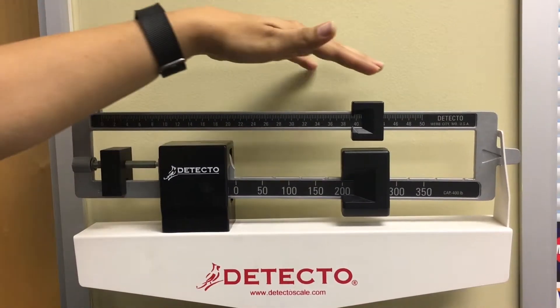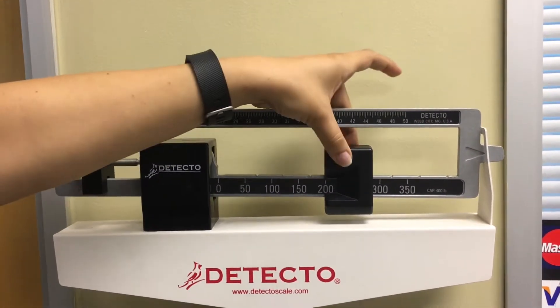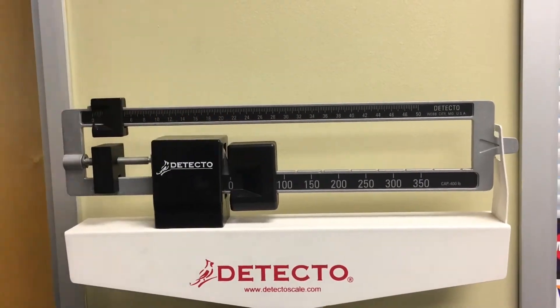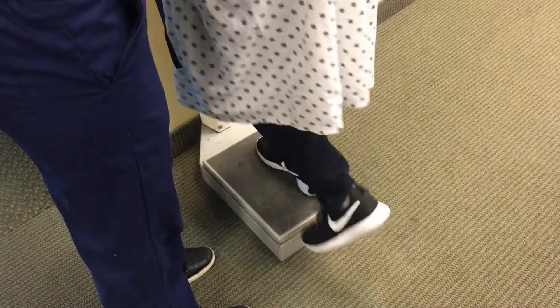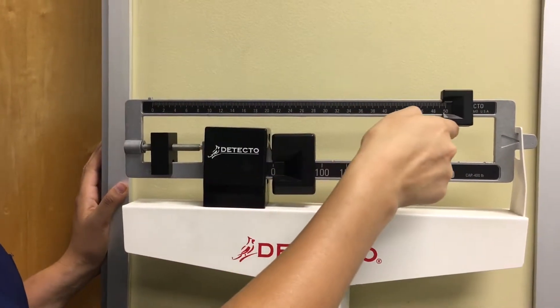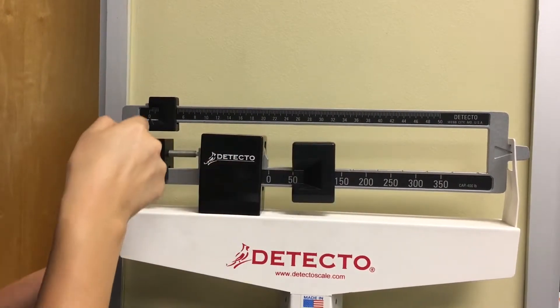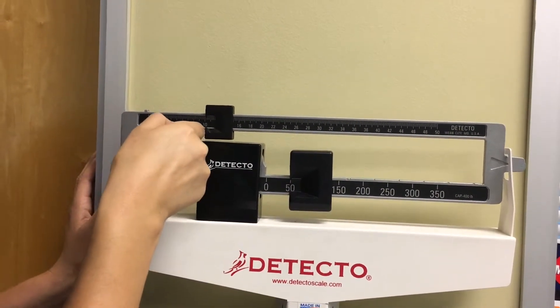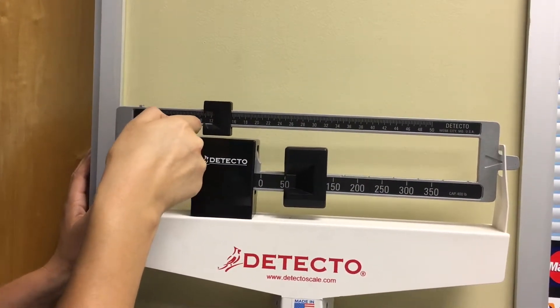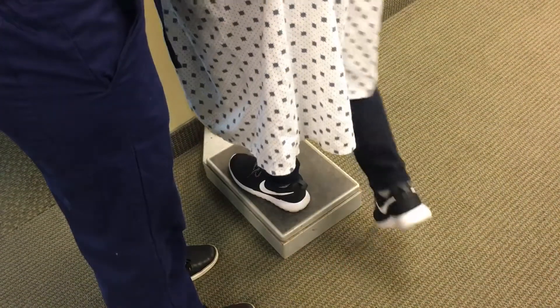Before the client steps onto the scale, set the scale to zero. Stand next to the scale and assist the client if needed onto the center of the scale. Once client is on the center of the scale, obtain client's weight.